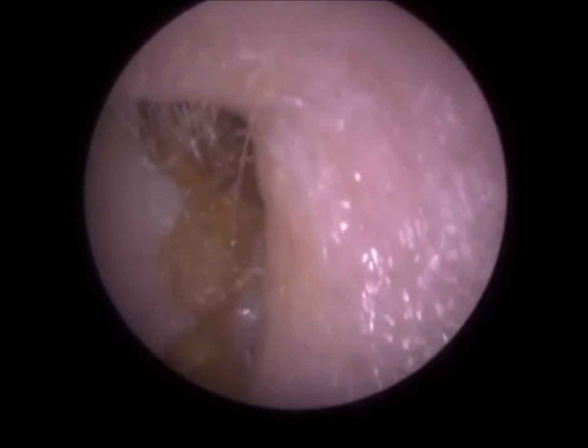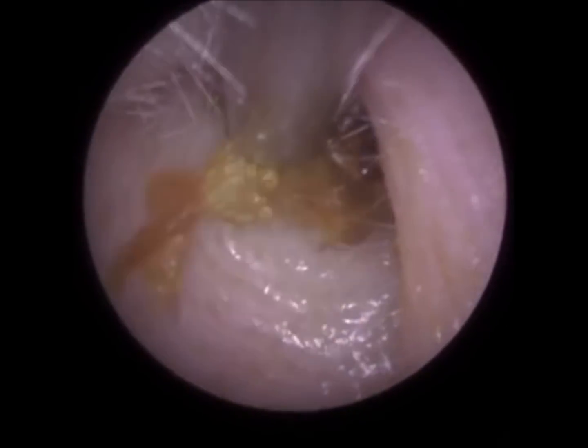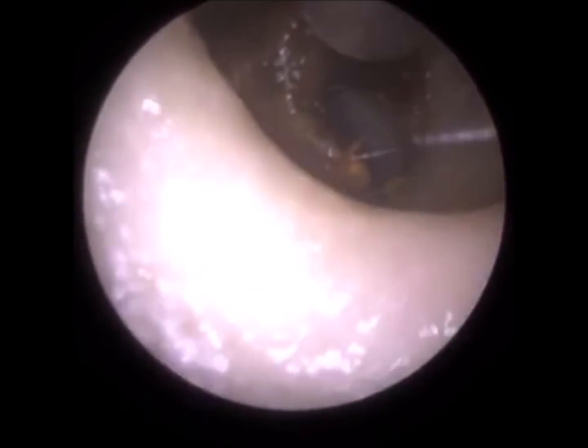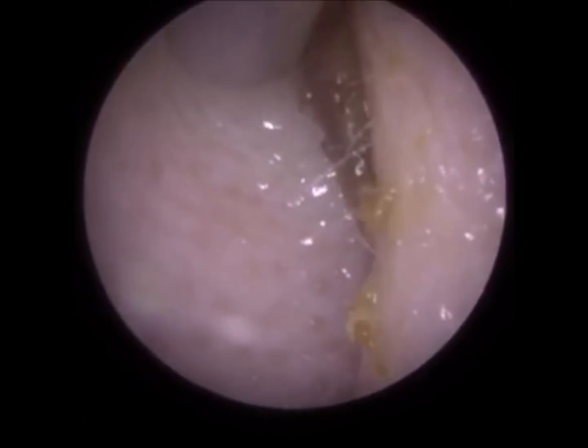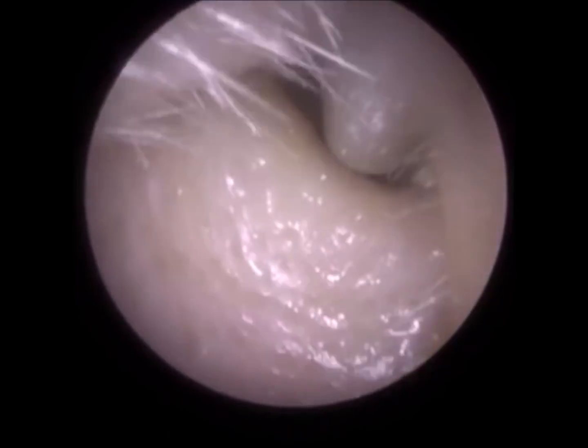Same patient, just the left ear again, just want to remove this wax as quickly as possible, as safely as possible. I had a bit of a narrow ear canal entrance, you can see there, but I'm able to enter the ear, stretch the ear open with the Zollner suction probe, which grants me access to the ear canal, just a bit at the base of the ear canal quite immediately.